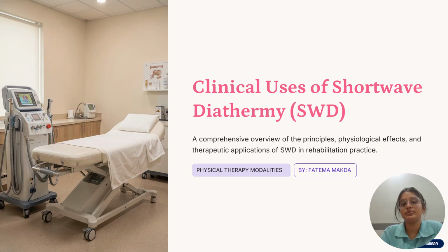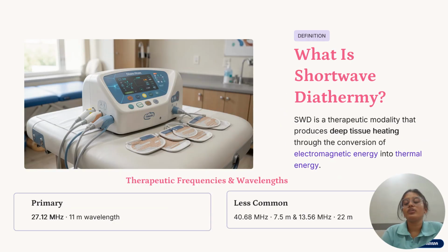Today I am going to explain to you about the clinical uses of shortwave diathermy. So let us start. What is shortwave diathermy first? It's a therapeutic modality which produces deep heating by converting electromagnetic energy into thermal energy.